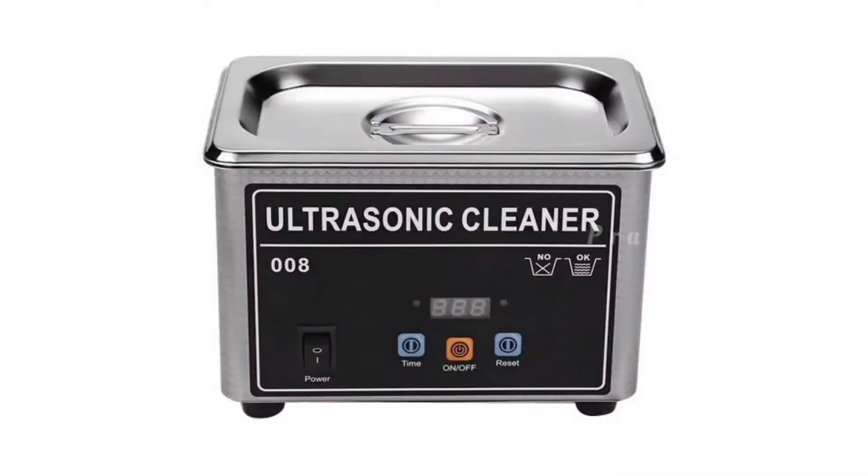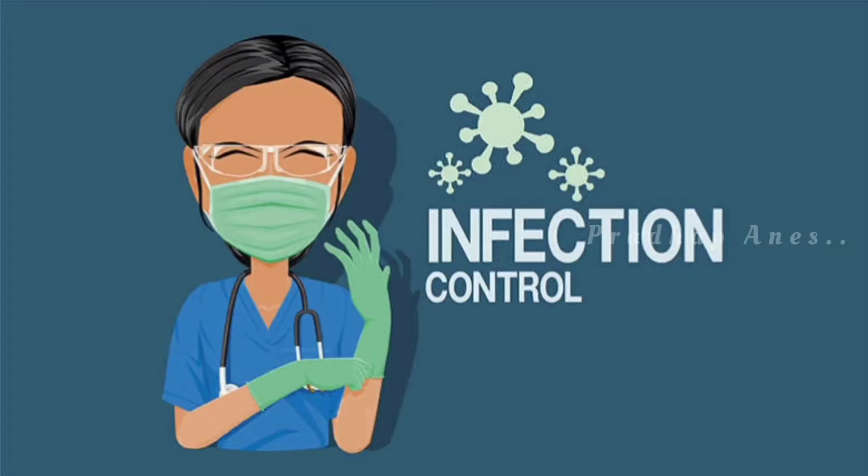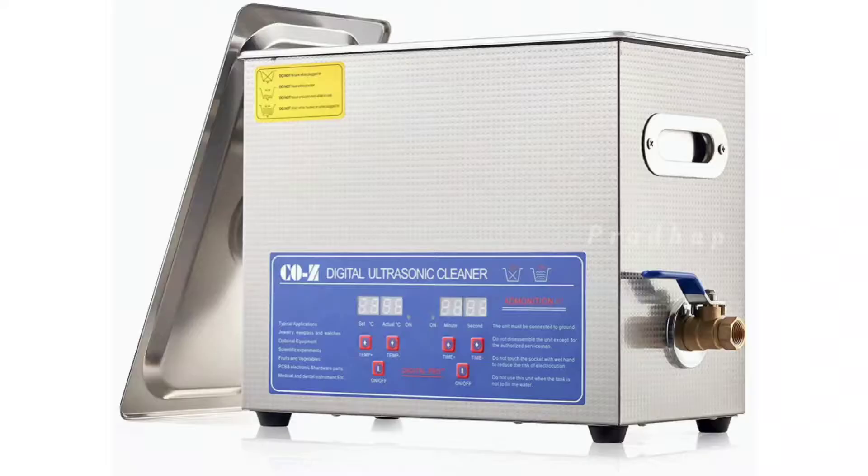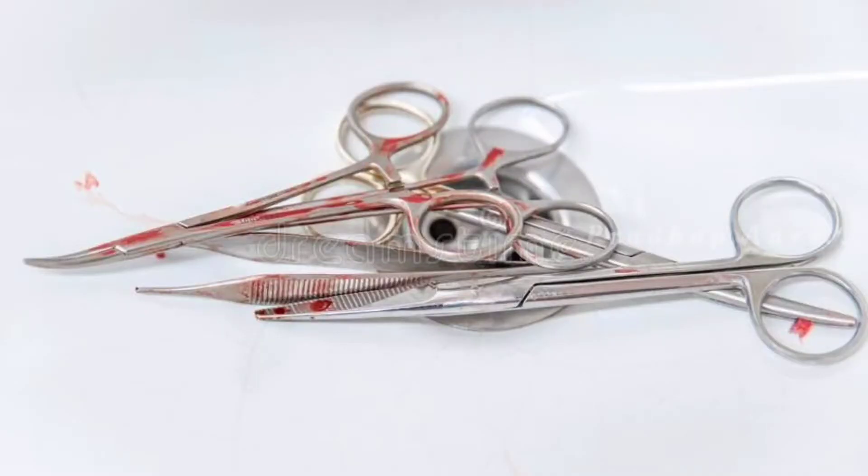These cleaners improve overall infection control and productivity by providing a safer method that is more efficient than manual cleaning. Ultrasonic cleaners easily and thoroughly remove blood, saliva, dirt, and other debris from the instruments without damaging them.